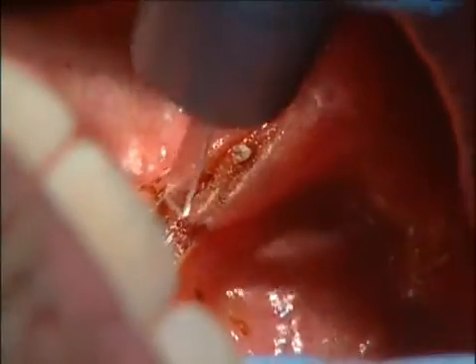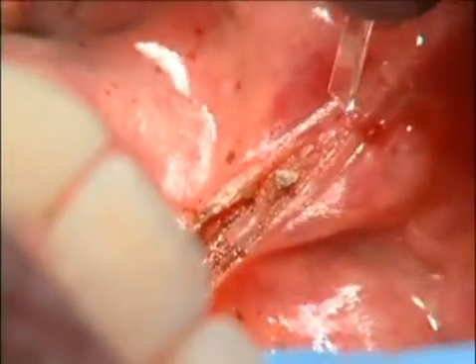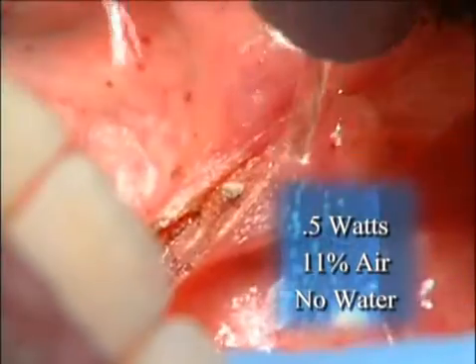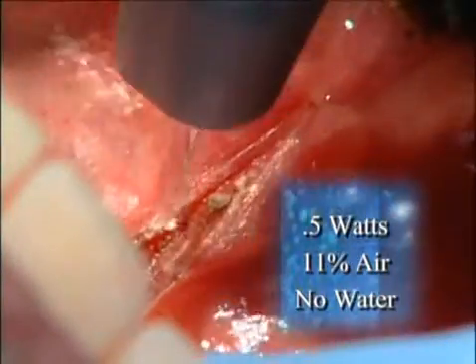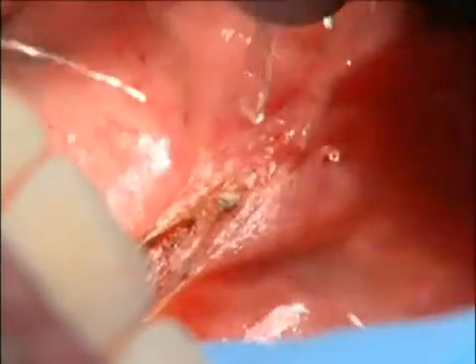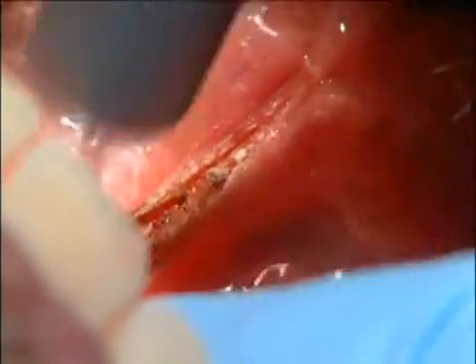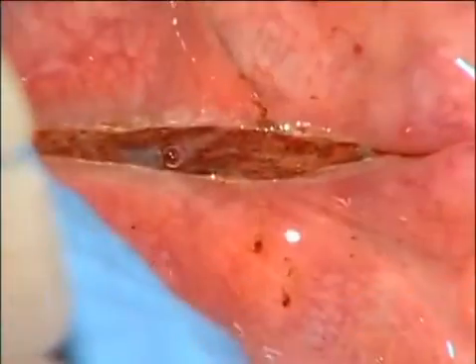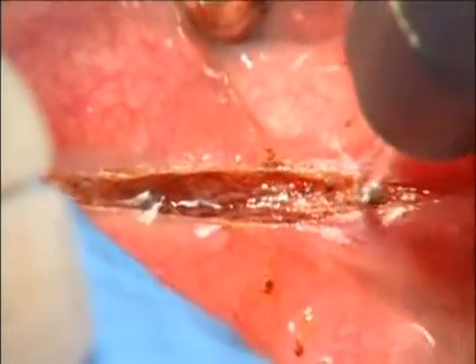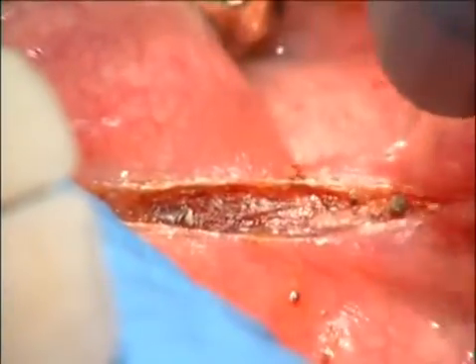And after the incision, we want to go back at a half a watt with 11% air, no water, to paint the tissue. This disinfects the wound, causes our magic laser wound healing to be initiated, and the patient will have no postoperative discomfort. It's very important to paint all tissue surfaces that we've lasered at a half a watt, 11% air, no water, before we let our patients go.